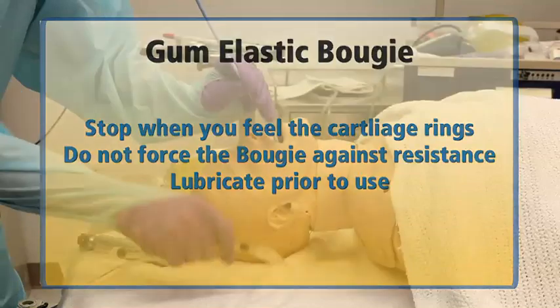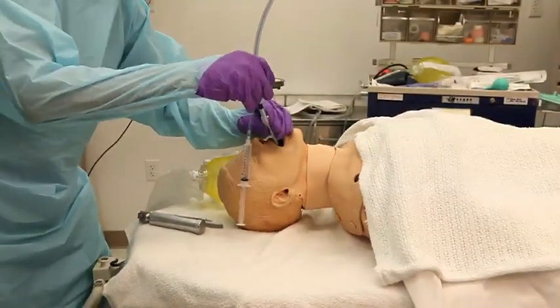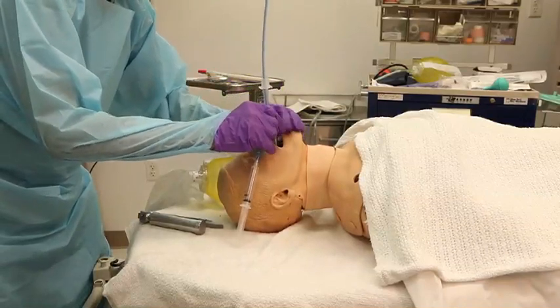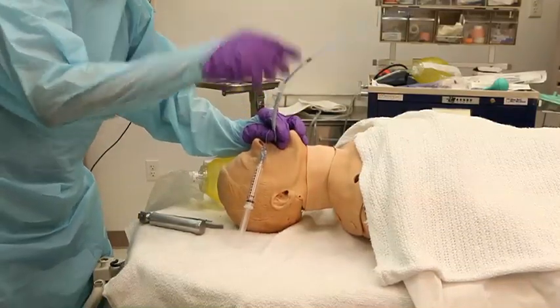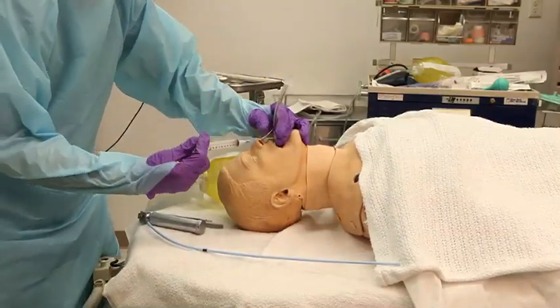Once the bougie is in place, hold the bougie near to the lips and slide the endotracheal tube over the bougie, then using the bougie as a guide, advance the endotracheal tube into the correct position, taking care not to withdraw the bougie until you feel that the tube is in adequate position.